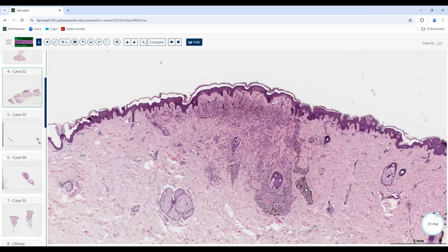Maybe. Well, we'll give you a Nexium or something for that, so you don't have to have heartburn from it. Vertical orientation, interesting enough, tends to be benign. So when something is vertically oriented up and down, that tends to favor benign.